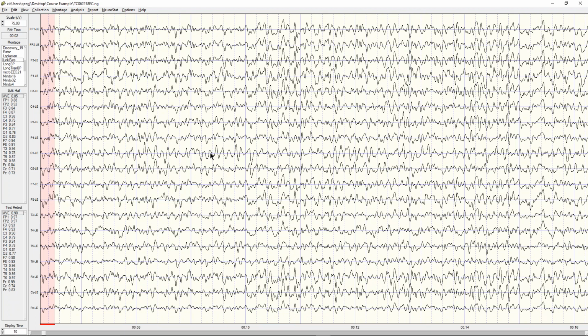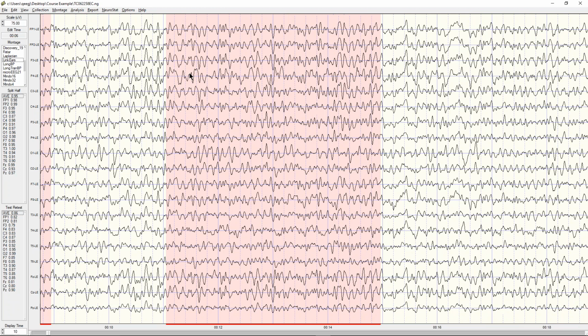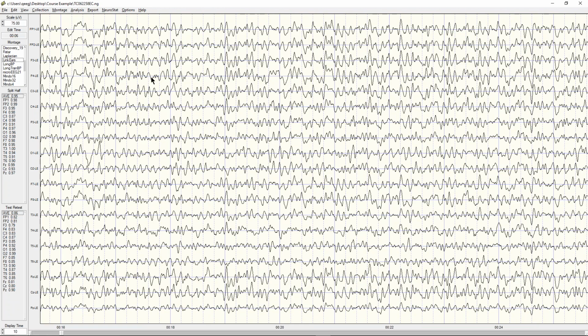I scroll through, and this may look like it's unusual, but it's actually real EEG. And it's pretty clean all the way to here. This is probably a little bit of a lateral eye twitch, so I should avoid that part, probably back to about there. This is actually pretty good in here. Now you can take small segments of as little as half a second, and you can take a 10-second segment if you've got a good continuous one.